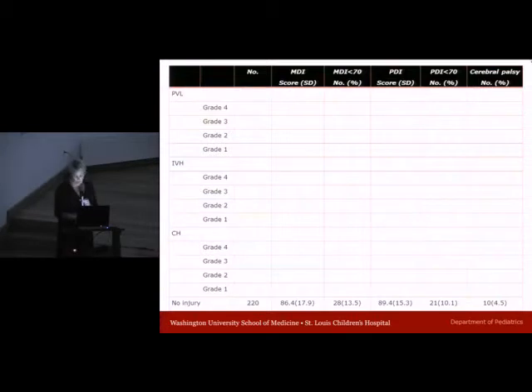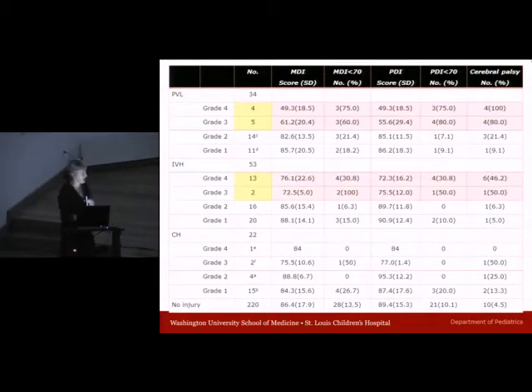So when you look at the remaining infants who lie within these other categories of injury, you can see here the coloured in ones are the ones who significantly deviate from the infants with no injury. And you can see, as you'd predict, grade 3 and 4 IVH, grade 3 and 4, i.e. this linear hyperintensity or cystic PVL.